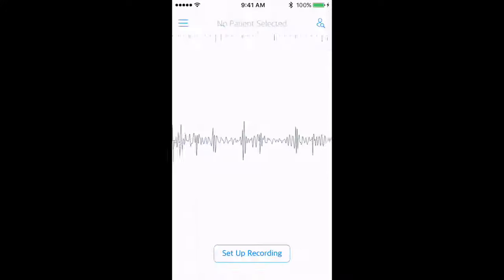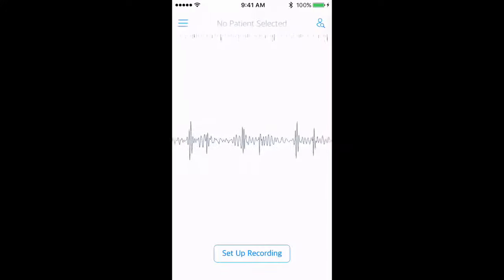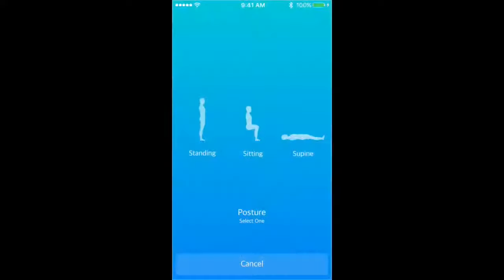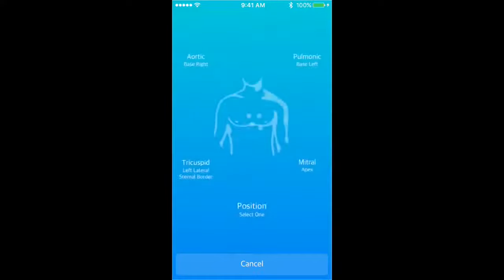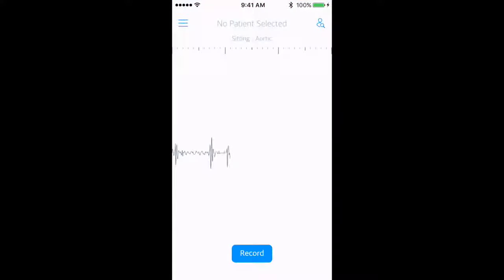You can now set up a recording and save it to a patient's file. Let's set up a heart sound recording by selecting the patient's position, sitting, and auscultation location.